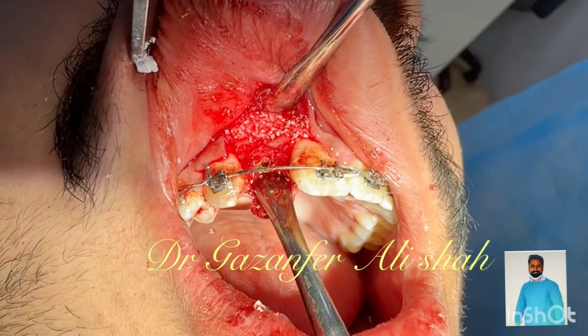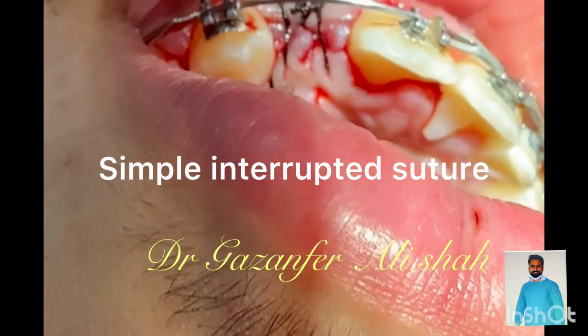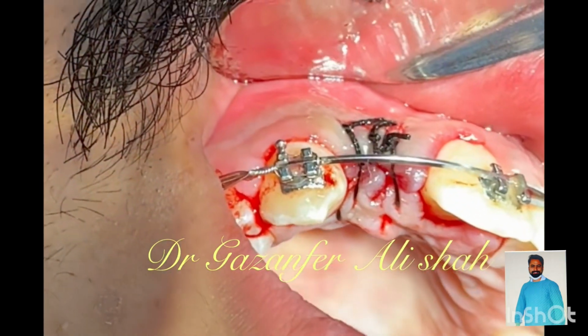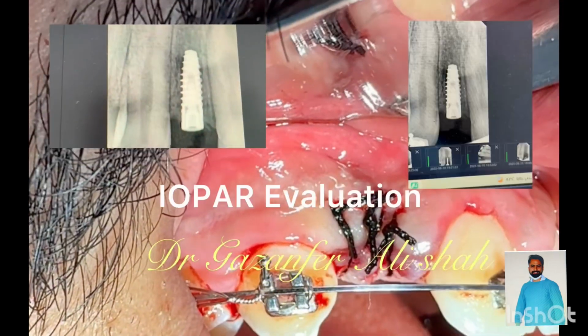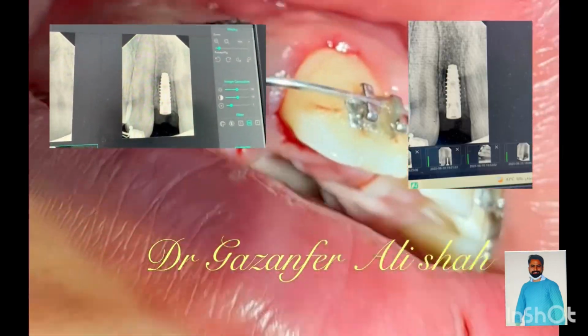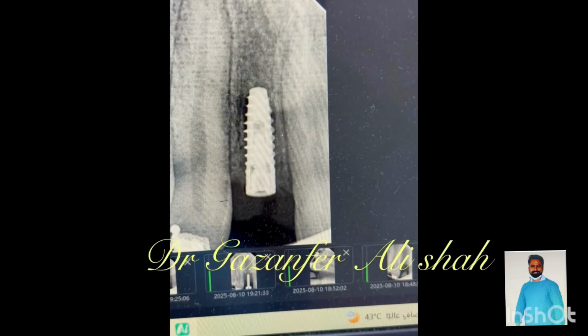After that, we are suturing the flap. We have sutured the flap with simple interrupted suture to achieve primary closure. You can evaluate closely. And to check its inclination with the adjacent roots, we are taking an IOPAR. We will evaluate this patient after 3 to 6 months for the final process.